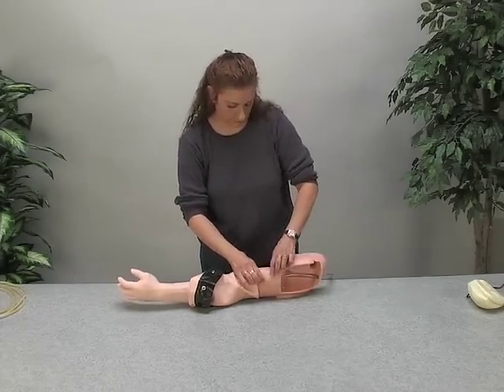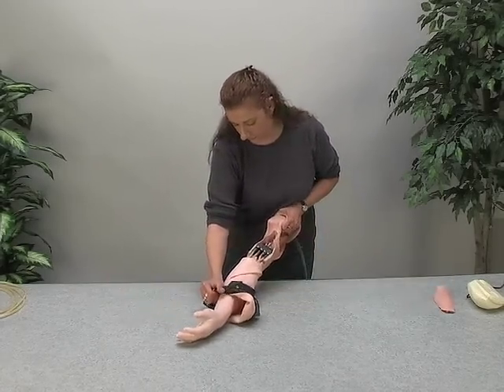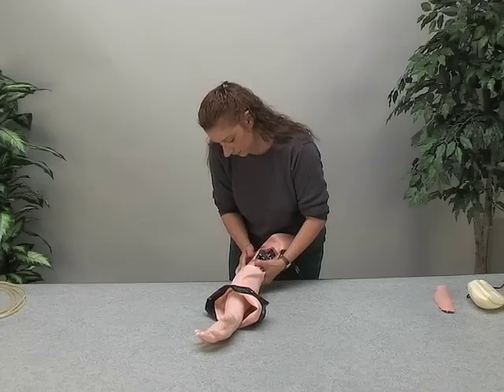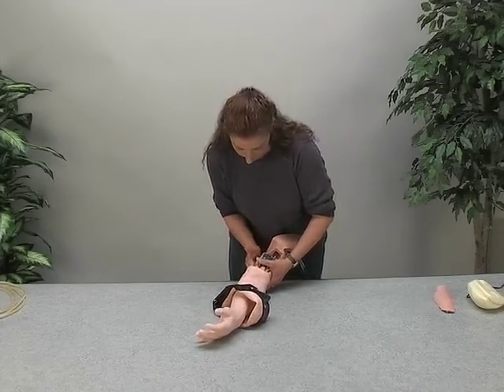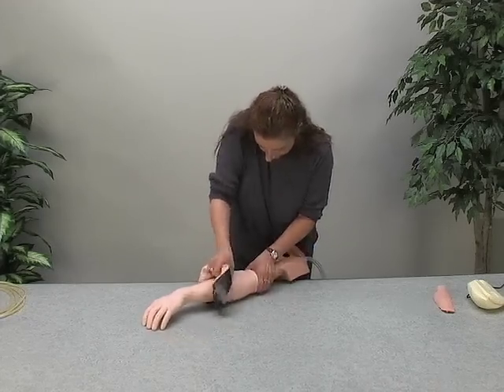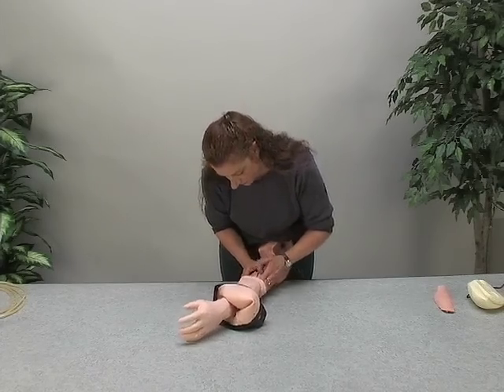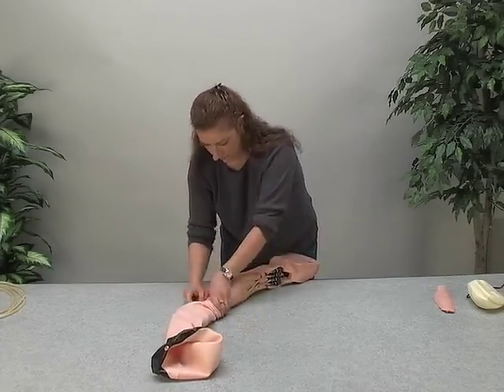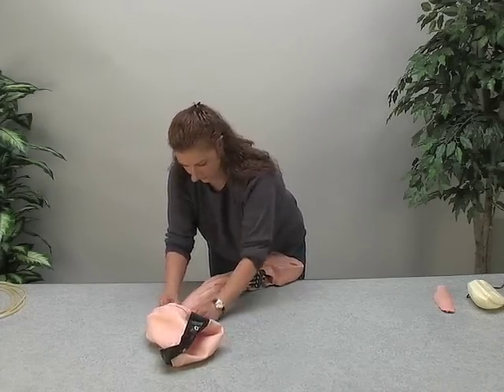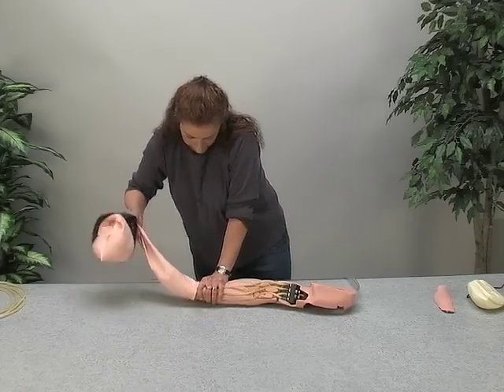Remove the foam shoulder pad. If the skin sticks, simply work the skin away from the arm. After disassembly, you can clean the arm with normal soap and water if needed. This will not affect future use.